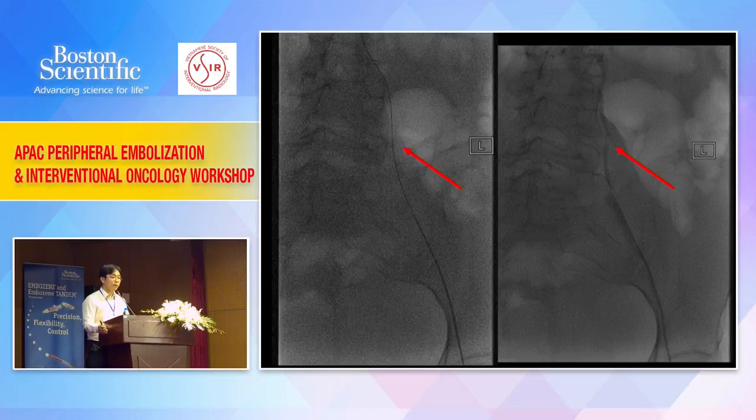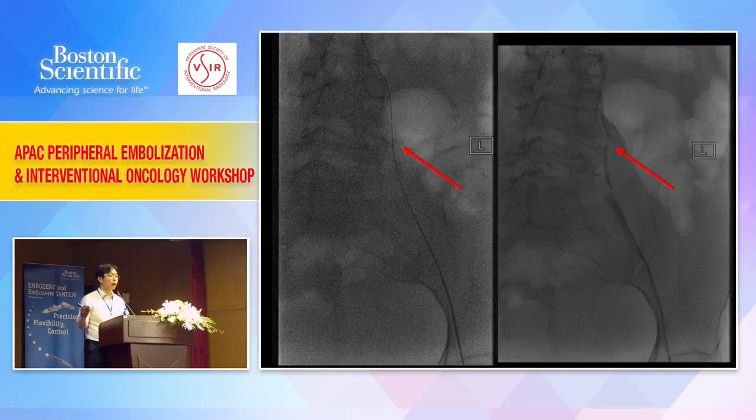So remember that your IVC, you must remember that the wire needs to go across the midline to the right side. If your wire looks like this, you are not in the IVC, okay? You are not in the internal, you are not in the common iliac vein. You are in some iliolumbar vessels, which on this picture tells you very clearly that you are in the wrong place.